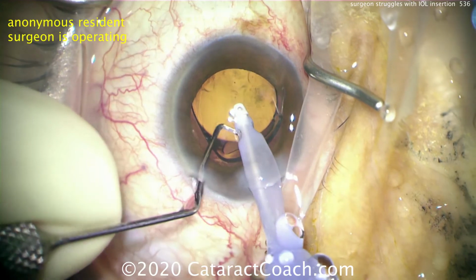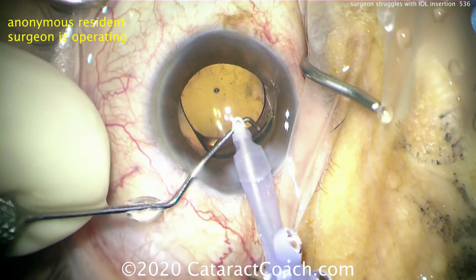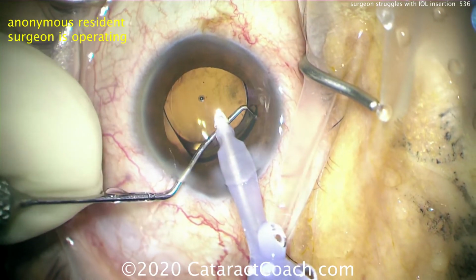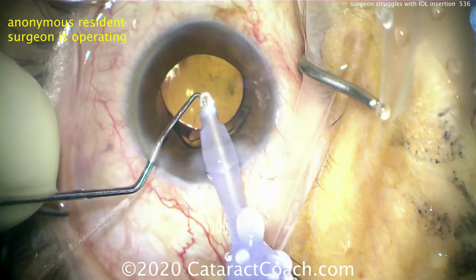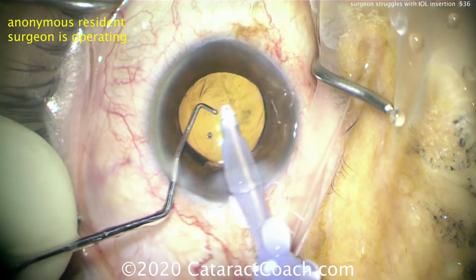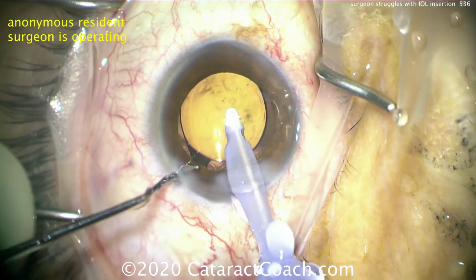So here's that trailing haptic, and the resident's going to get that into position, hopefully. That needs to go in the capsular bag. As we know, you can never leave a single piece acrylic lens in the sulcus. In fact, you can't even leave it partially in the sulcus. You definitely don't want one haptic in the bag, one outside the bag. So that looks a little bit better.